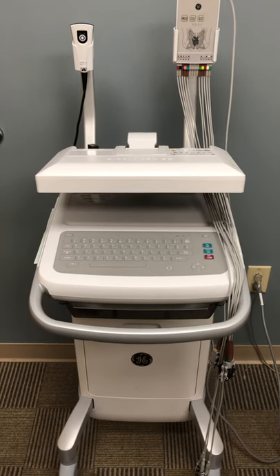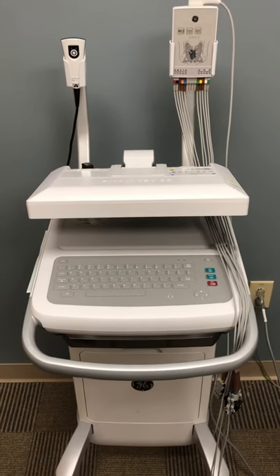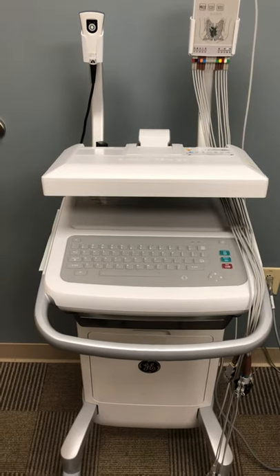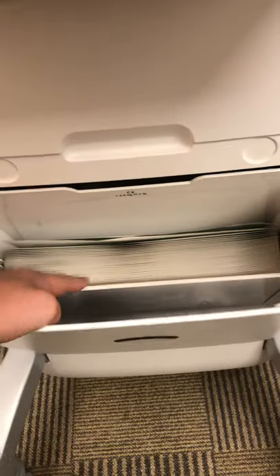At first glance, the battery life on the machine is about four hours, so try to leave it plugged in as often as possible. This little drawer in the front stores extra paper if you need it.